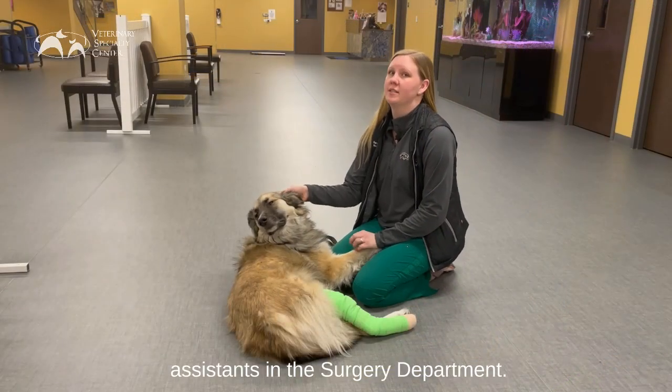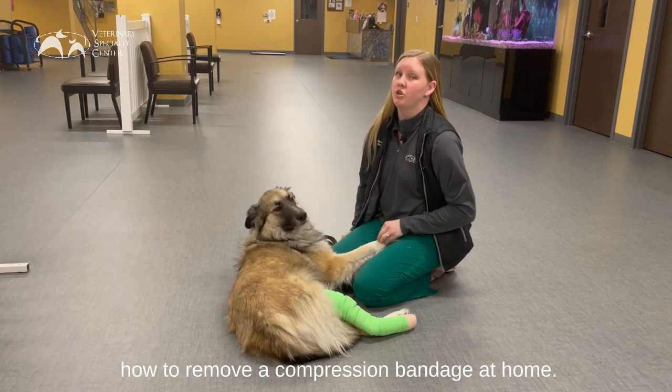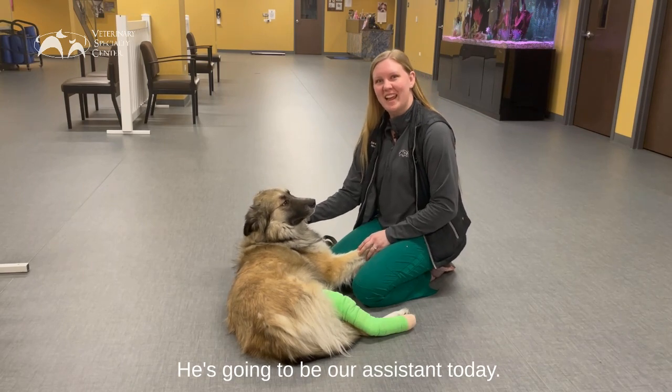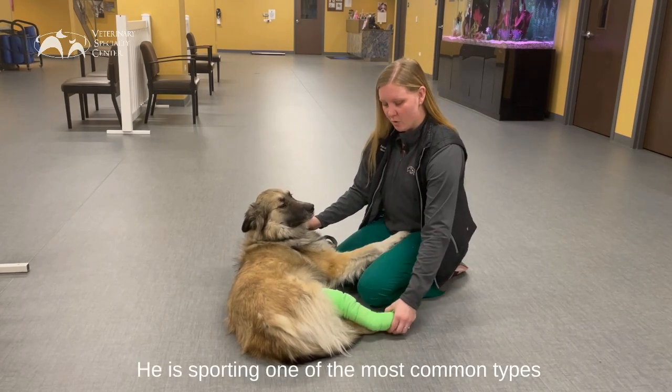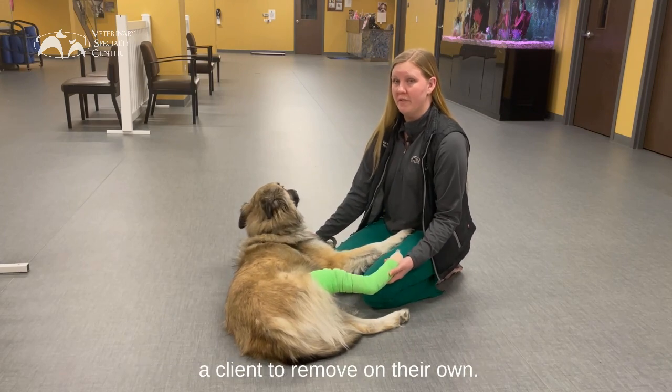Hi, my name is Sarah. I'm one of the technician assistants in the surgery department and today we're going to be talking about how to remove a compression bandage at home. This is Kramer. He's going to be our assistant today. He is sporting one of the most common types of bandages that we will send home and instruct a client to remove on their own.